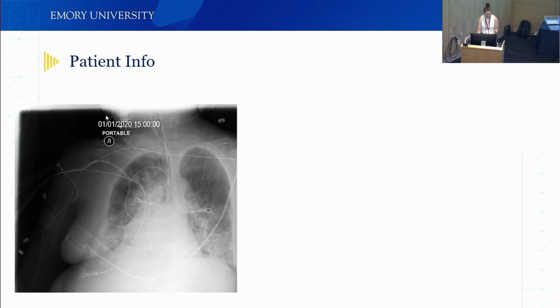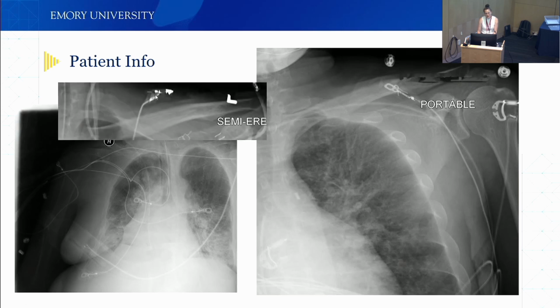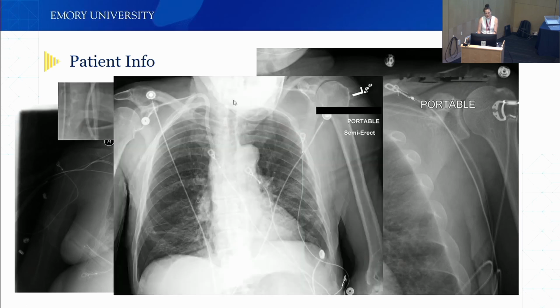This is fake, because I cannot just show times and dates. So what we've done is create an algorithm that removes them, but you can see it here in the image. It causes a little bit of blur. You can see it especially when it falls over some of these metal things.